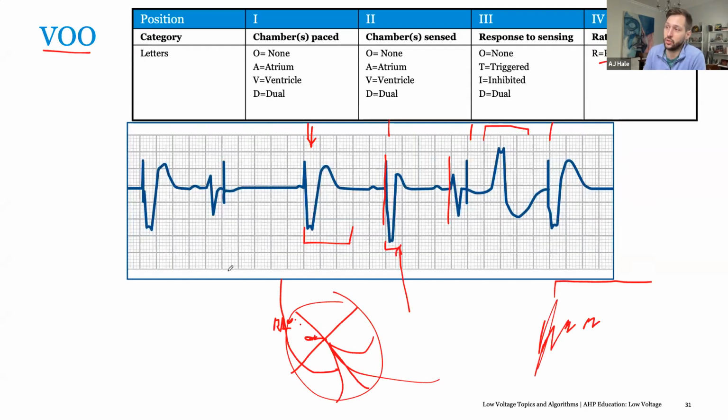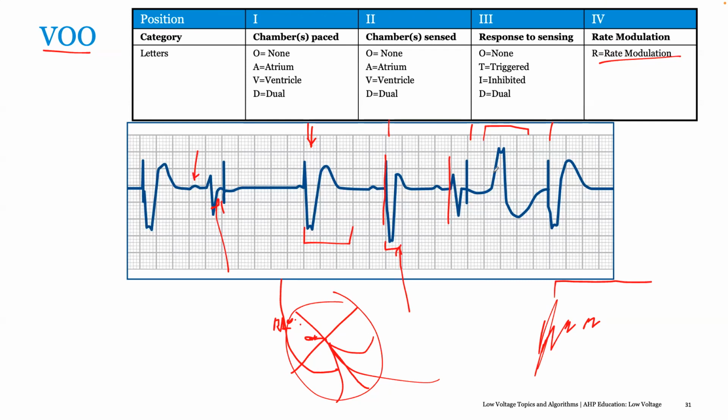Anytime you're pacing into a T wave, you run the risk of being proarrhythmic, so you could pace them into VT or VF. In those cases, that is why we would increase the heart rate. The idea being that we would beat out any kind of intrinsic activity, and we would beat out any kind of PVCs, because you're controlling the refractory period of the tissue. And by doing that, you limit the instance of that occurring. Does that make sense? Yes, it does. Thank you. Yeah, perfect. That was a great question.